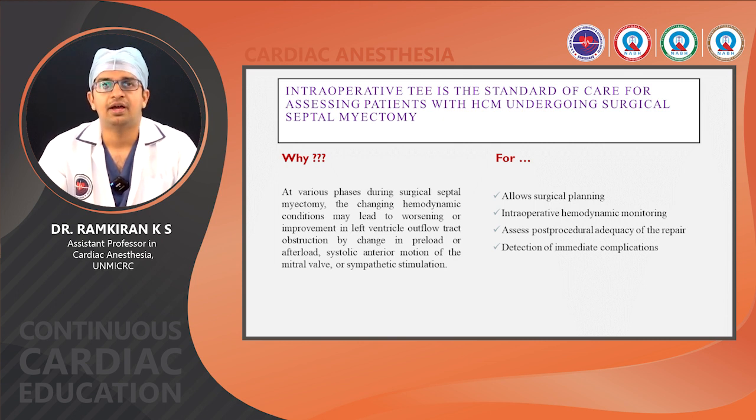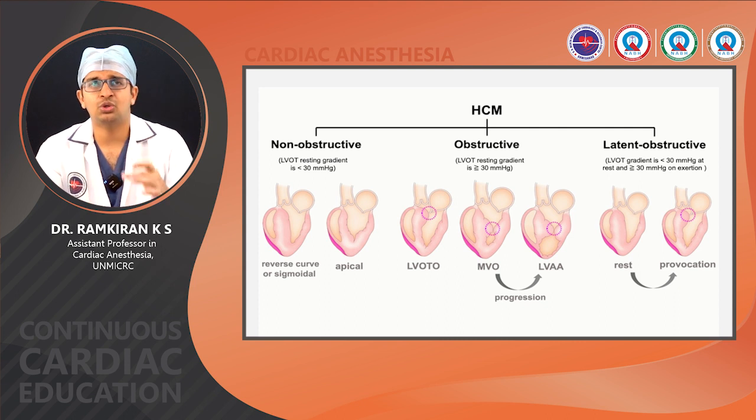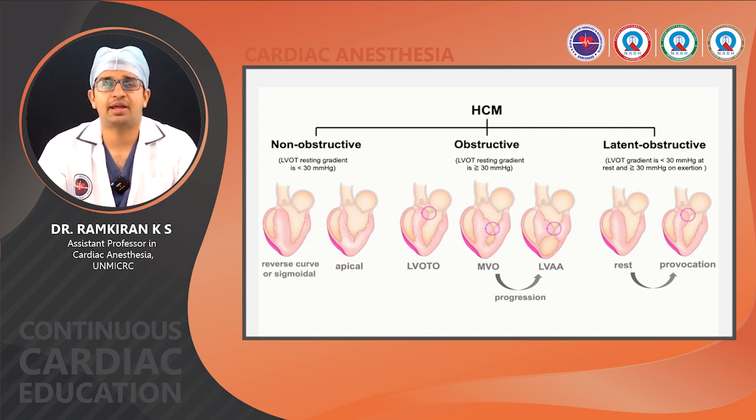All this helps in allowing proper surgical planning, intraoperative hemodynamic monitoring, assessing post-procedural adequacy of the repair and detection of immediate complications. So, a few slides just describing the pathophysiology and types of HOCM.